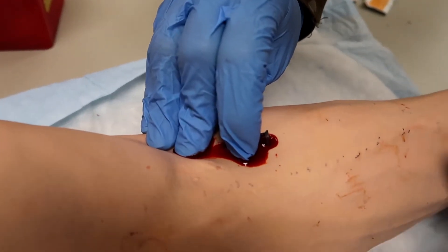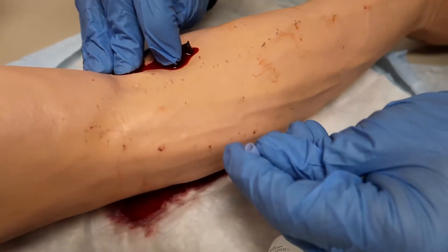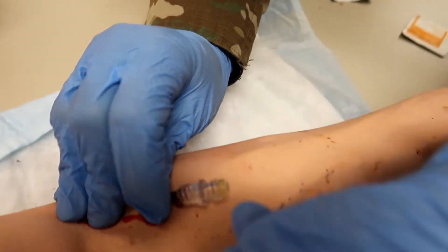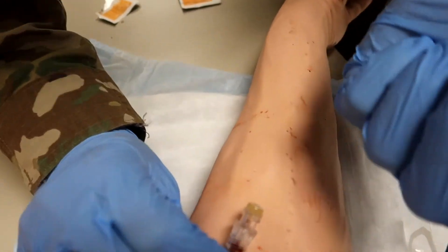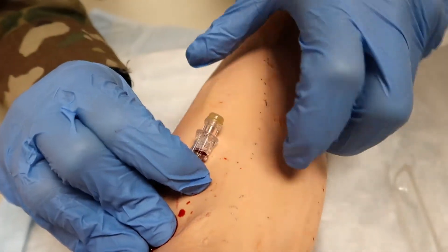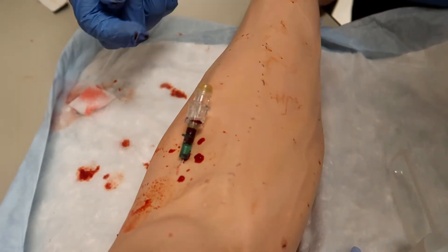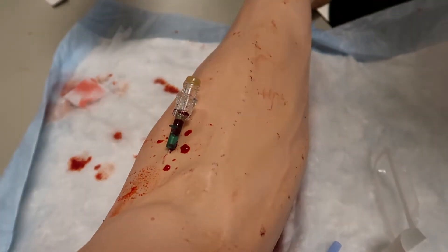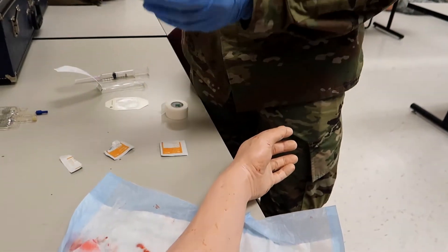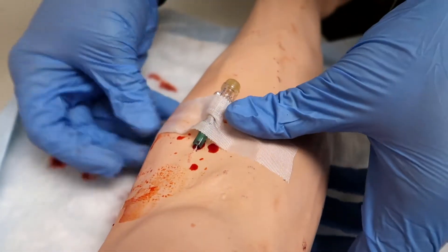This arm is bleeding more than usual because it's pressurized, just like an actual vein would be. Now he's going to connect the saline lock and place a strip of one-inch tape. The biggest thing is that you want to hold on to the hub — if you try to turn the saline lock onto the hub without holding it, the whole catheter is going to start turning in their vein, which is going to be extremely painful for the patient. He's secured the saline lock and now you have venous access. He prepared his one-inch tape in step two, so it won't stick to his gloves.